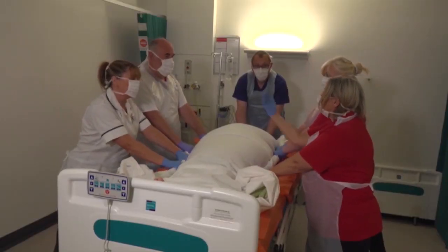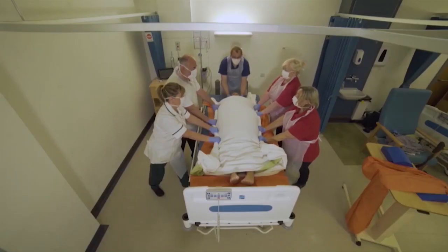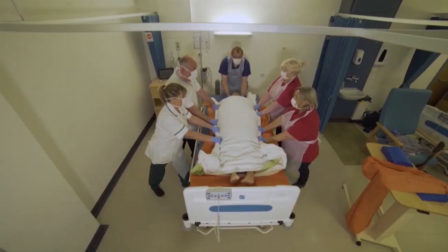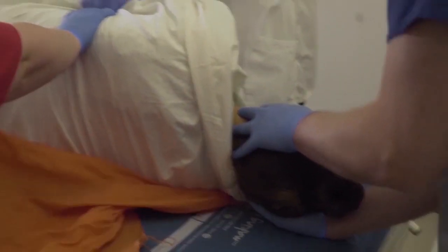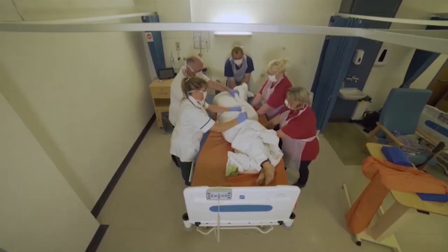First of all, you're going to push towards and then we're going to move up, and then we're going to stop partway through. You're managing the head. Ready, steady. Get a hold there, get a hold of the slide sheet. Ready, steady.